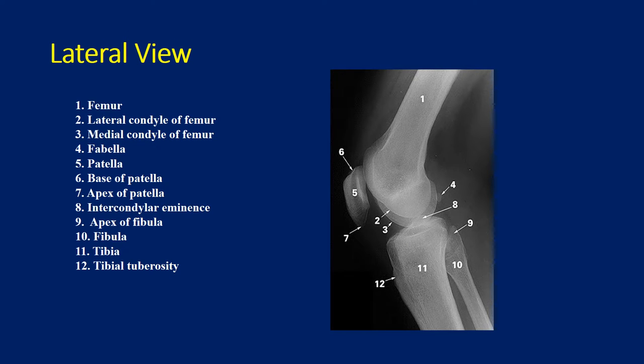The lateral view is a good view to see the patellofemoral joint, distal femur, and proximal tibia. You can identify fractures. You can see the contour of each condyle, as well as the tibia and the patella.